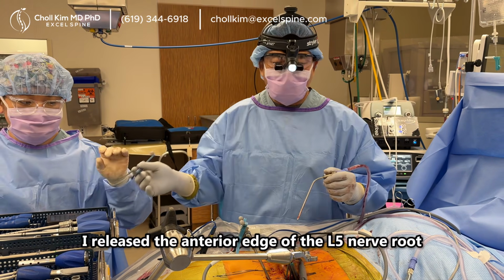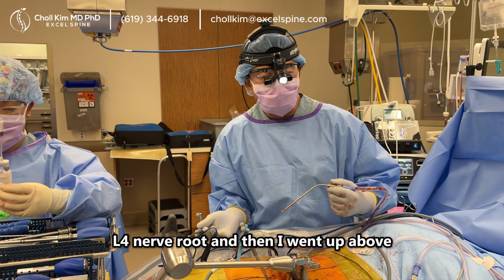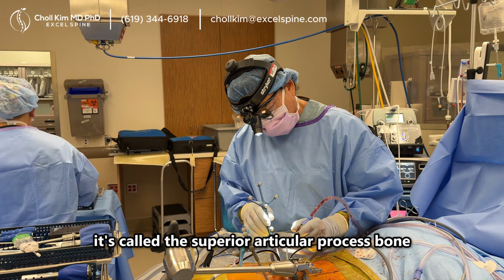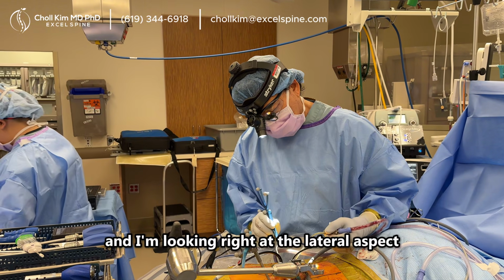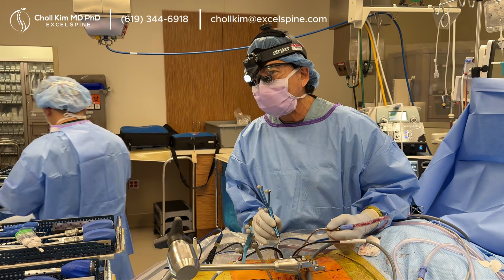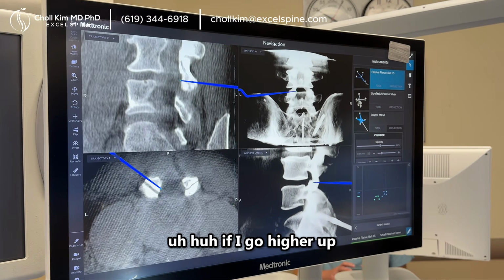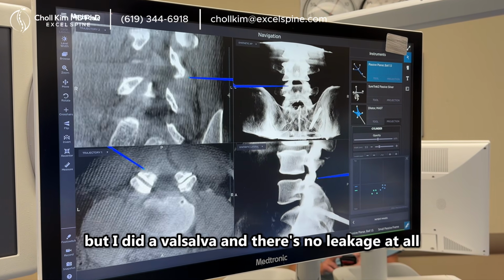I released the anterior edge of the L5 nerve root, L4 nerve root, and then I went up above, and the bone, which is basically the facet joint bone, it's called the superior articular process bone. That's gone. And I'm looking right at the lateral aspect of the dural tube surrounded by scar tissue. And you can see, look at that. If I go higher up, that's where the pseudomeningocele is. But I did a Valsalva and there's no leakage at all.